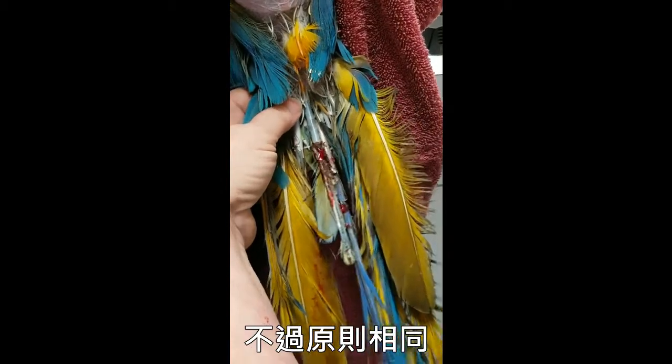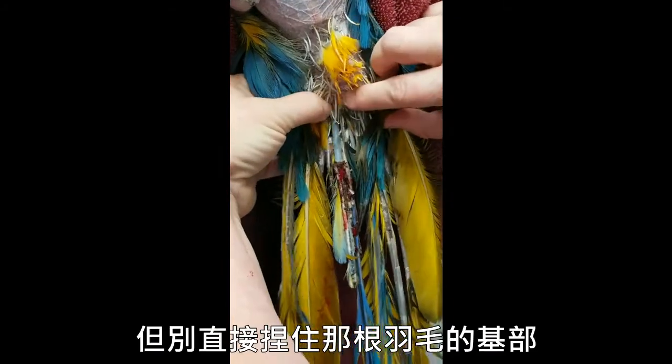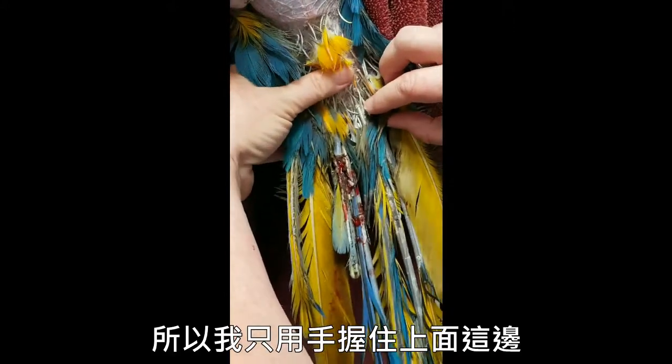The same principles apply. You've got to hold on to the bird to stabilize the body, but you don't want to hold on right over the base of that feather because you'll be pulling against yourself. So I'm going to just brace the finger up here near the vent.